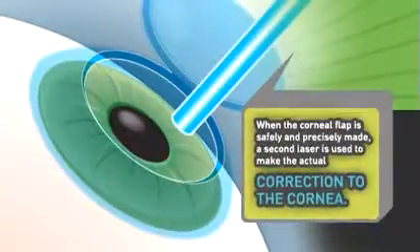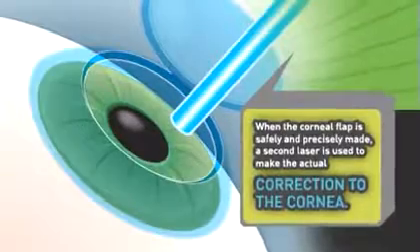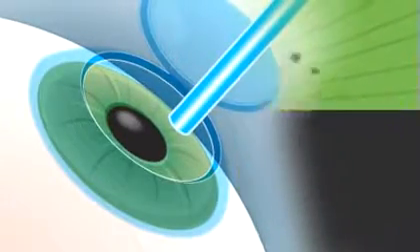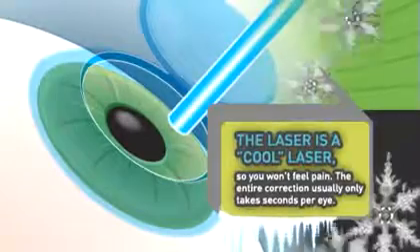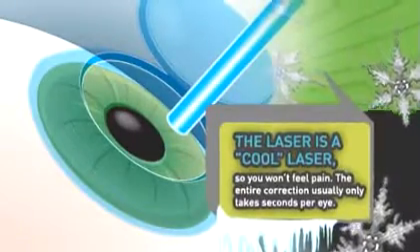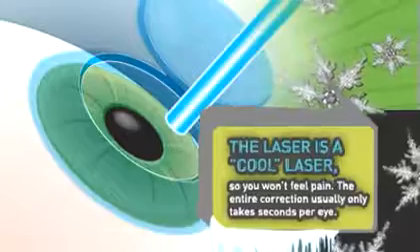When the corneal flap is safely and precisely made, a second laser is used to make the actual correction to the cornea. The laser is a cool laser so you won't feel pain. The entire correction usually only takes seconds per eye.